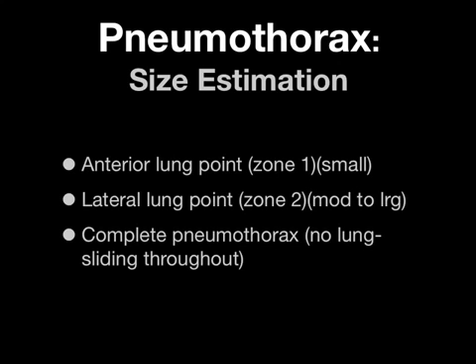So go past being able to just say yes or no. Try and use this in a useful fashion. Since this is a highly sensitive test, make sure that you can get an idea of size estimation so this test will be of utility for you.